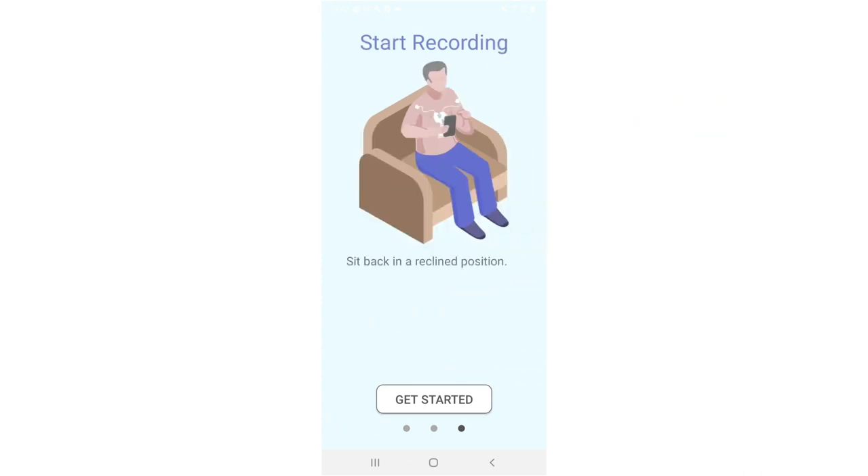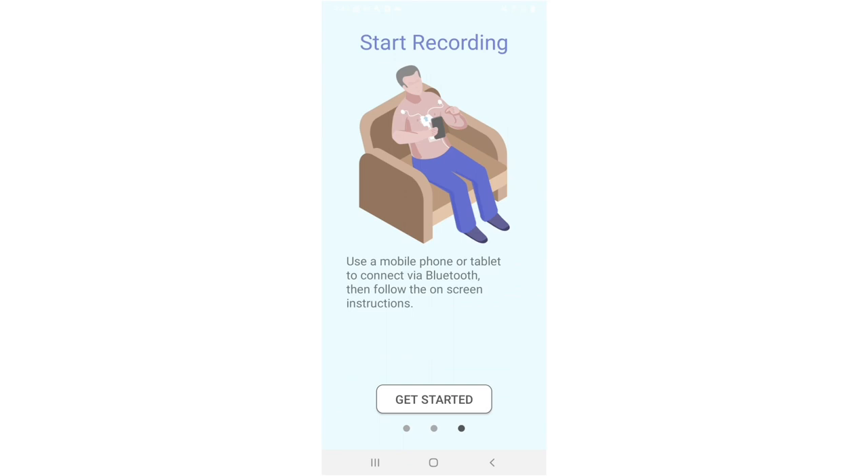Start recording. Now sit back in a reclined position. Relax your muscles. Use a mobile phone or tablet to connect via Bluetooth, then follow the on-screen instructions.